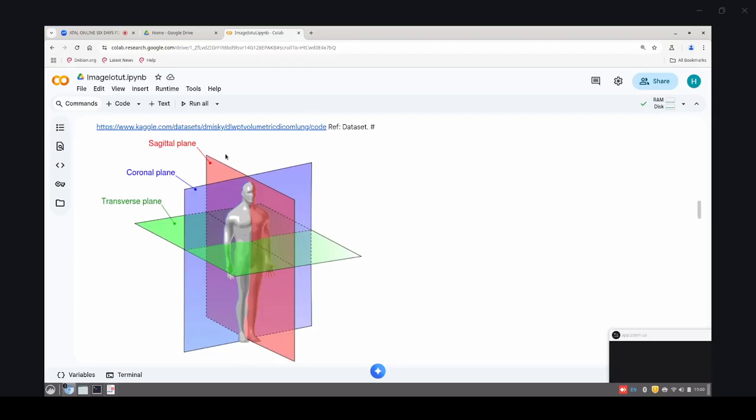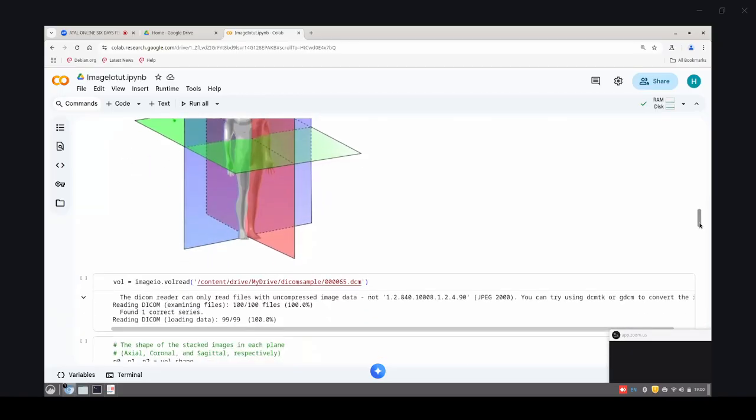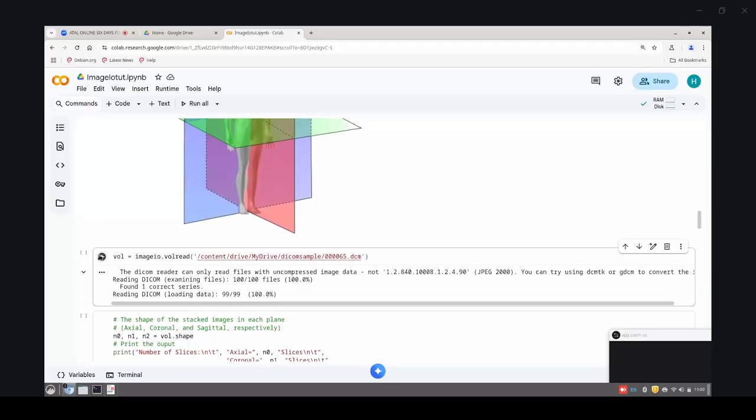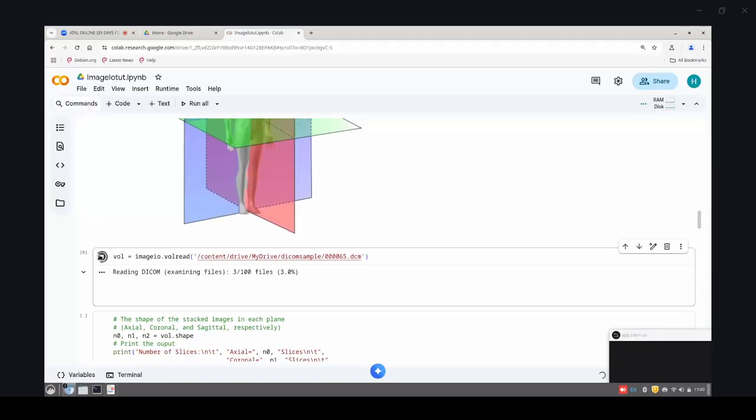So we make slices of that 3D image, which is like a bread, along the transverse plane, coronal plane, or sagittal plane to get the different CT scan images. It's not in one image that you have to detect a disease; you have to detect diseases in all the slices along the human body to make the CT scan diagnosis.